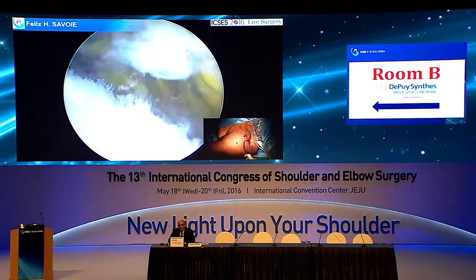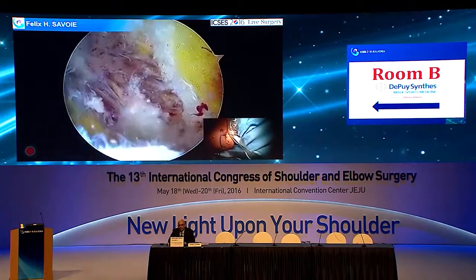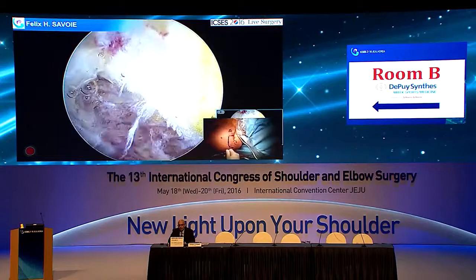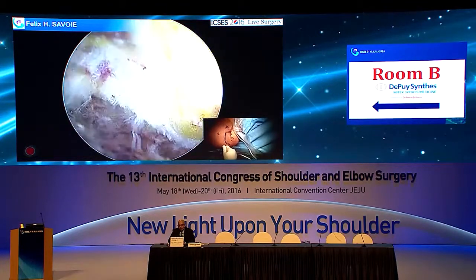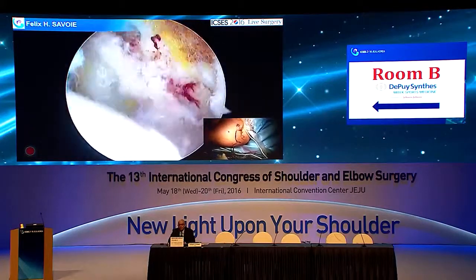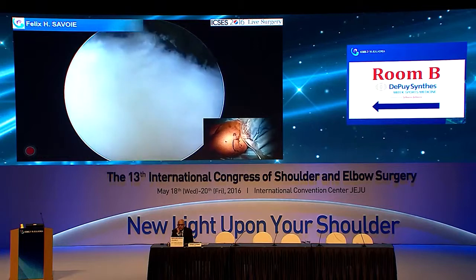Now, I will tell you that before we got started, I did clean this up a little bit and do a decompression. As you can see here, there was a lot of fraying on the lateral acromion if you look at the inside view. And so we took that back and tried to change her critical shoulder angle. And if you look down at the cuff, it looks pretty good. It's not really retracted.